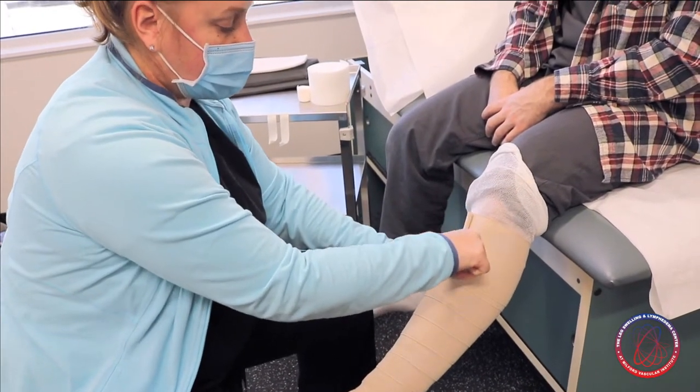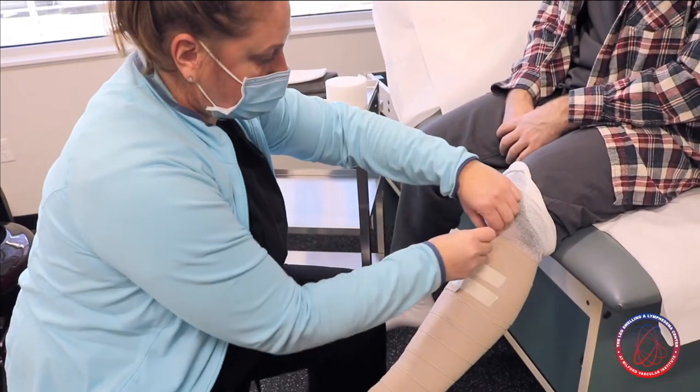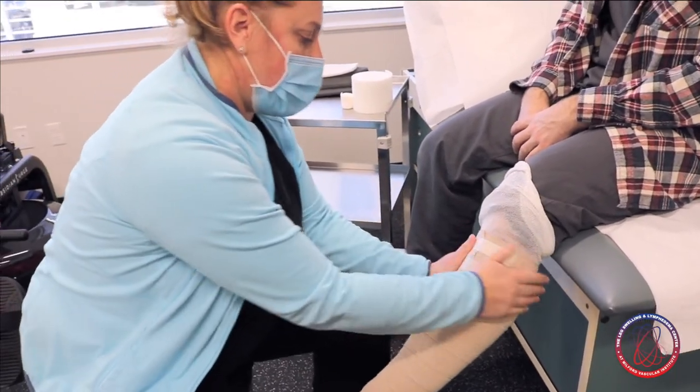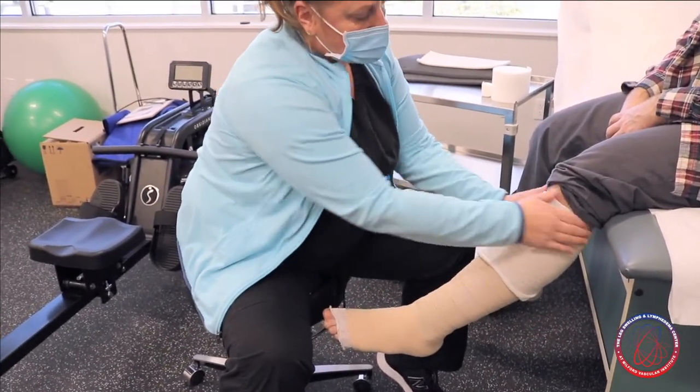Then we take our trusty tape — I use masking tape, nice and easy, you can find it anywhere — to secure the end of that bandage. We don't want to use those little clips; they can be dangerous and can cut the skin. We do not want that, especially on lipedema patients. Then the stockinette pulls down over the top to protect and act as a buffer.